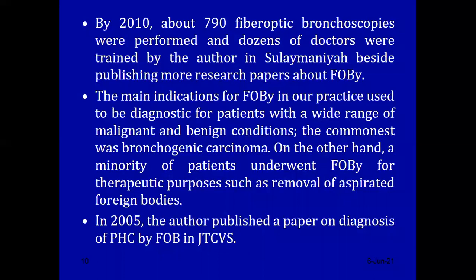The main indications for fiber optic bronchoscopy in our practice used to be diagnostic for patients with a wide range of malignant and benign conditions. The commonest was bronchogenic carcinoma. On the other hand, a minority of patients underwent fiber optic bronchoscopy for therapeutic purposes, such as removal of aspirated foreign bodies.